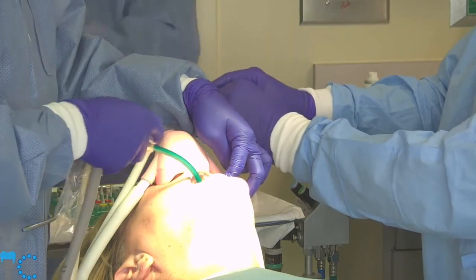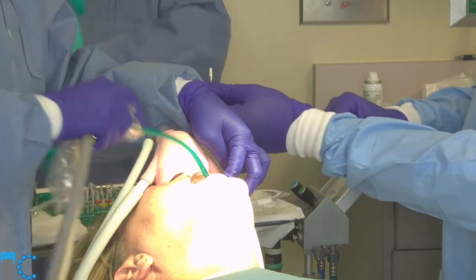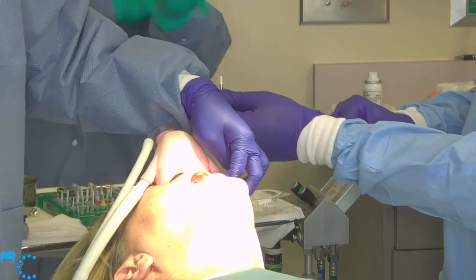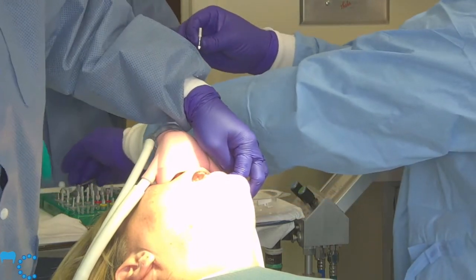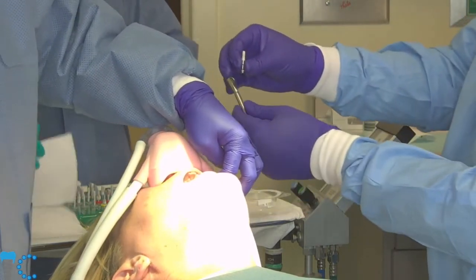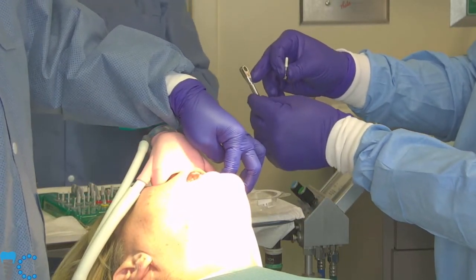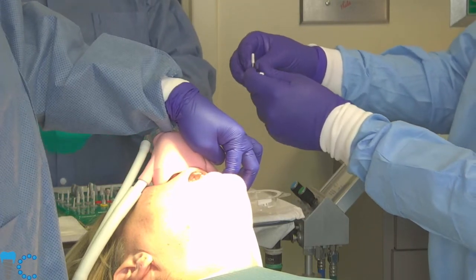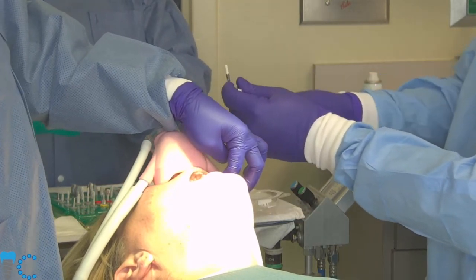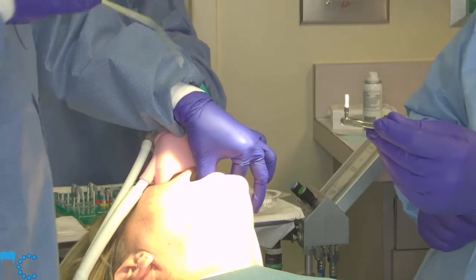So what I'm going to do is my placement instrument just snapped right in there. Can you see that? Mm-hmm. So I'm going to not touch the implant, and I'm going to get the surgical ratchet. It says out on this side, and the other side says in. So the out side is going to face our implant, just like this. This is what we're going to take to the mouth.